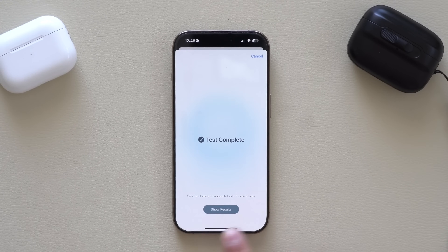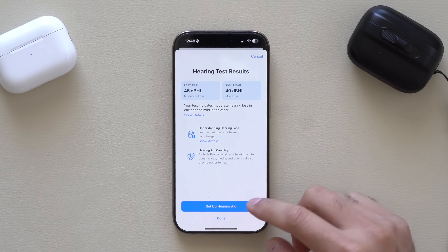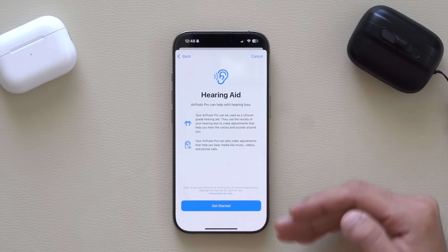Let's go ahead and retake this test and this time let's purposely fail. Now let's check these results — oh man, these are awful. It's recommending that we set up a hearing aid. I purposely failed so I'm not surprised. Here, walk through everything and just hit Get Started.